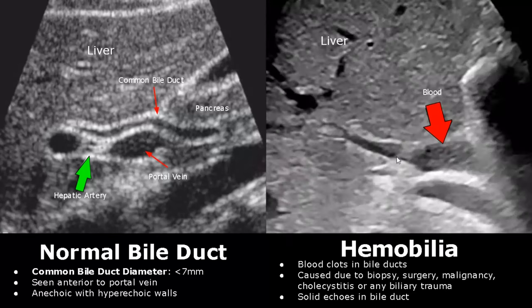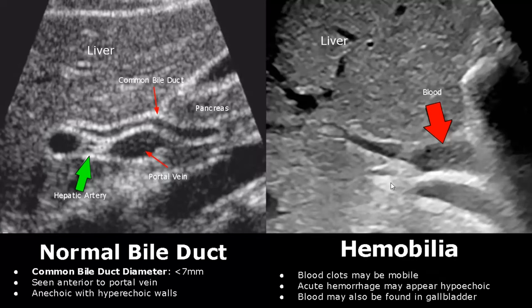Hemobilia refers to blood clots in bile ducts; it usually occurs after a biopsy in this area. It can also occur due to surgery, malignancy, cholecystitis, or any biliary trauma. Solid echoes will be seen in the bile ducts, and the blood clots may be seen floating and moving. In acute hemorrhage, the bleeding is fresh and may appear hypoechoic because the blood hasn't clotted yet.